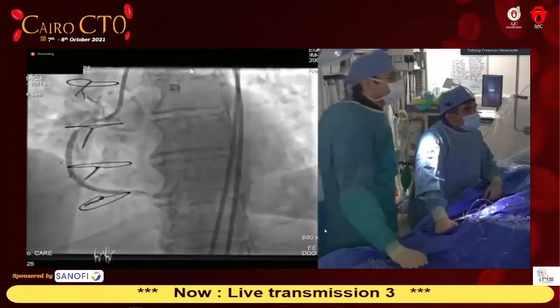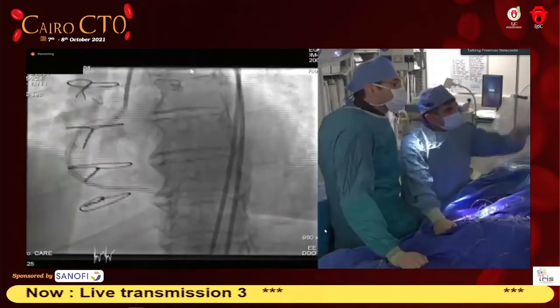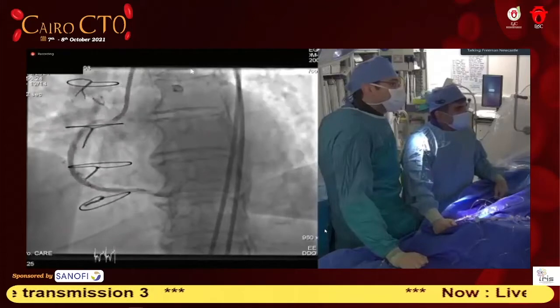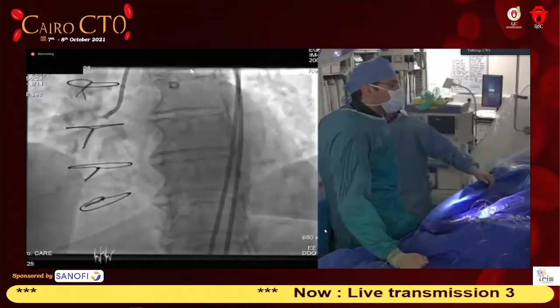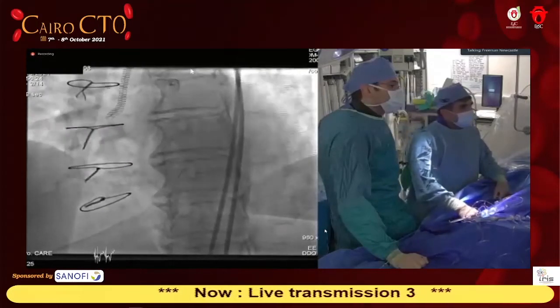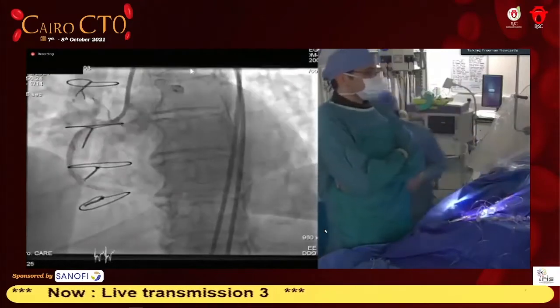So getting some of the, I think we have a hematoma distally, or maybe that's just an edge enhancement because the stent from the vein graft are coming on top of the artery. So we'll take a picture in a minute in the cranial view. I think this is a hematoma, distal? Distally, might well be. I doubt it because if you see where it was before, it's gone. But let's see, we'll see in a minute.